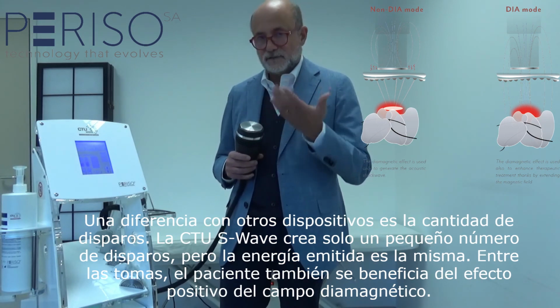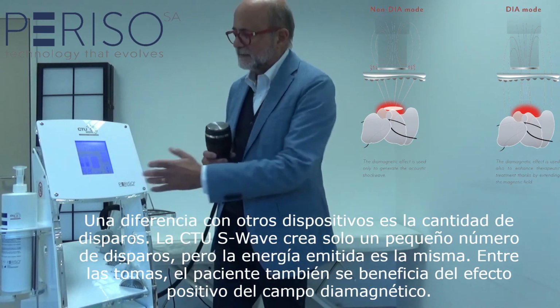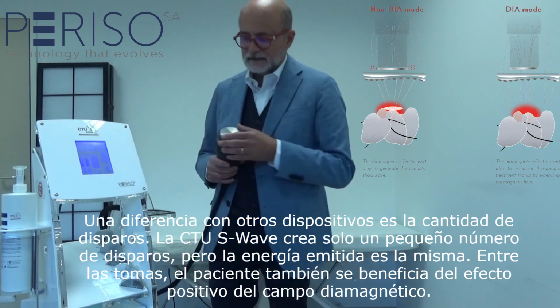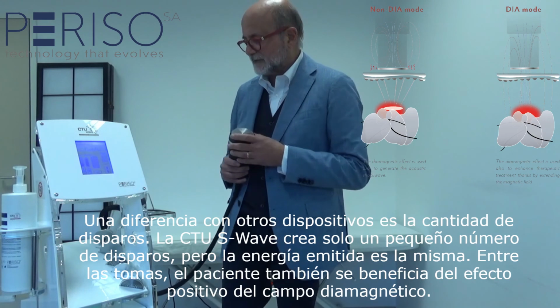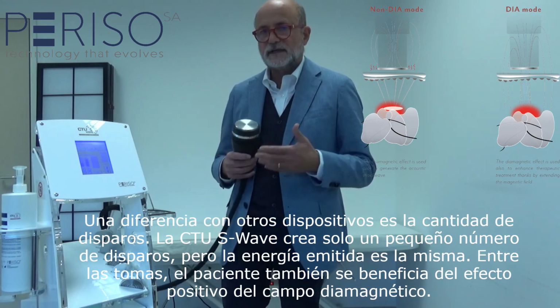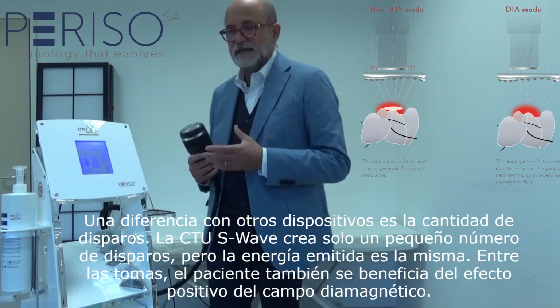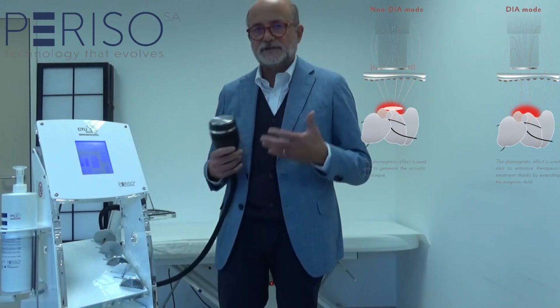an adjunctive biological effect. So I can modulate the diamagnetic effect, moving the flow, varying the flow of the magnetic fields. But all these things you can appreciate with the application of the shock waves delivered by the machine in the patient.